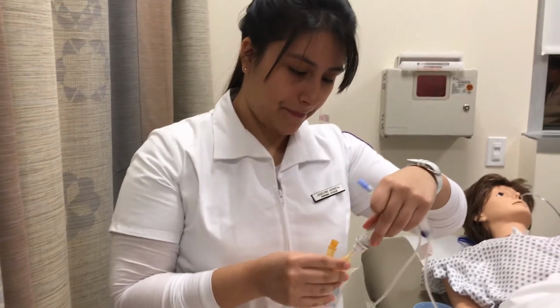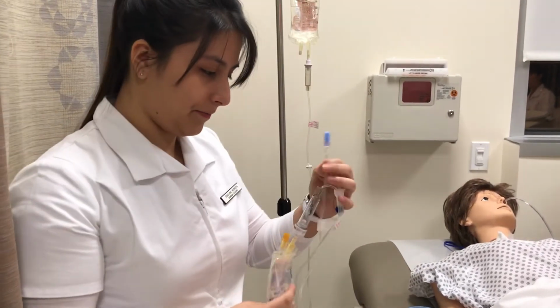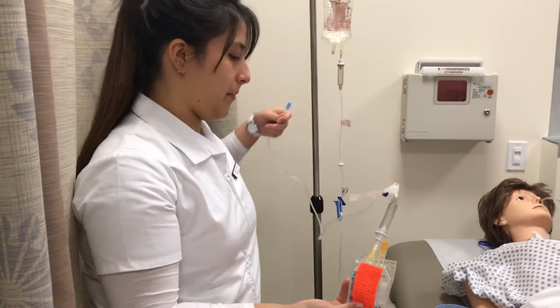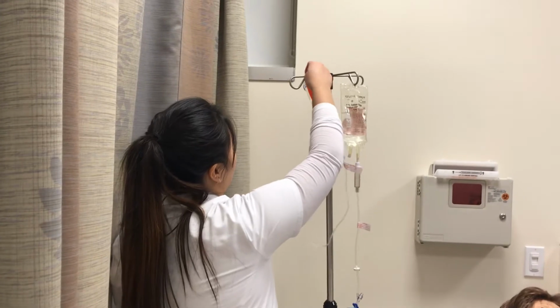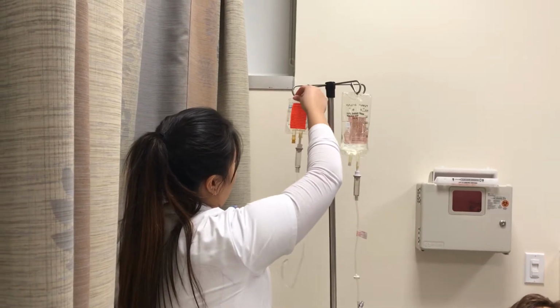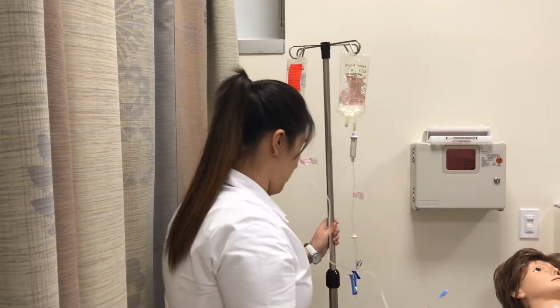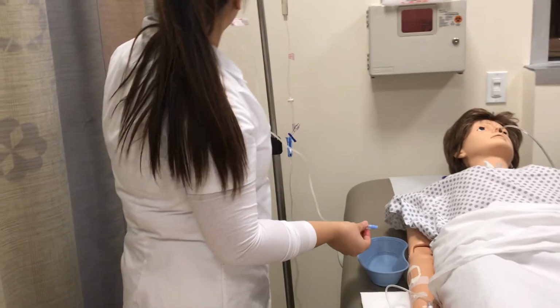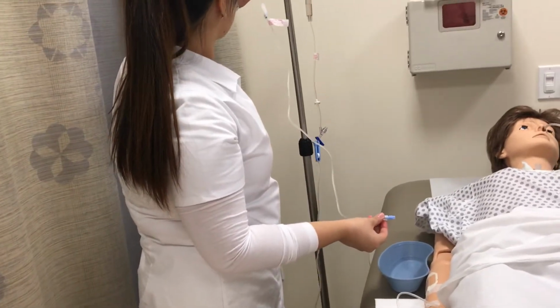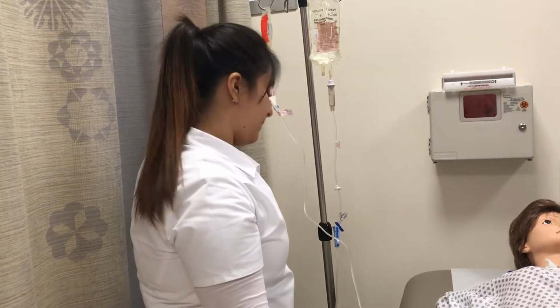And now I'll be putting it on my IV pole. So I'm going to be priming it. I'm making sure my chamber is filled halfway.